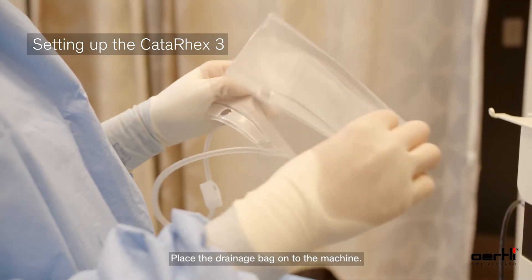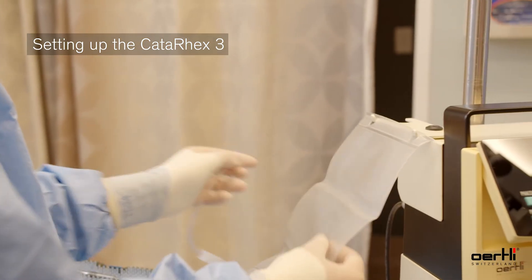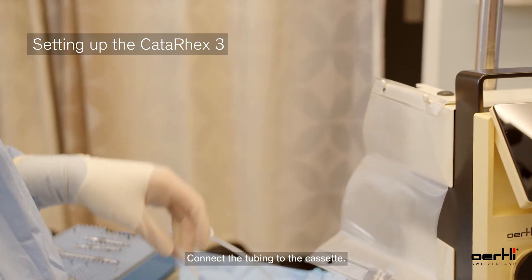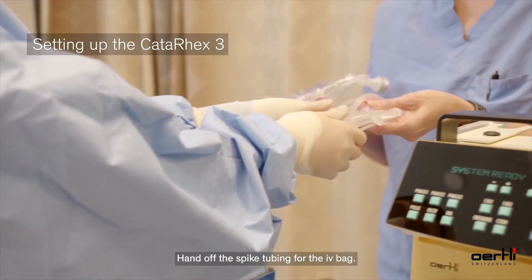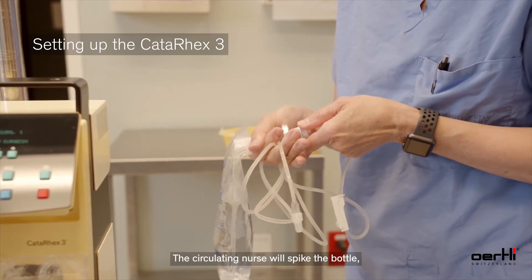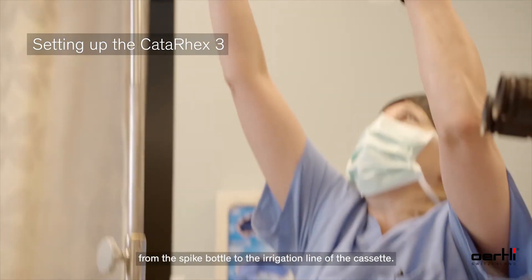Next, place the drainage bag onto the machine. Connect the tubing to the cassette. Then hand off the spike tubing for the IV bag. The circulating nurse will spike the bottle and make the connection from the spike bottle to the irrigation line of the cassette.